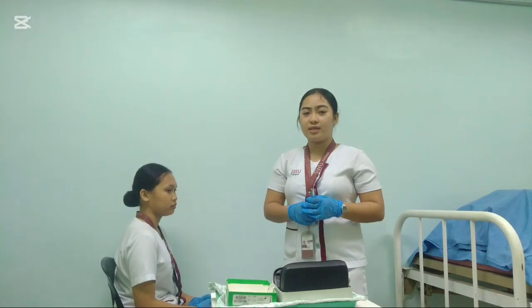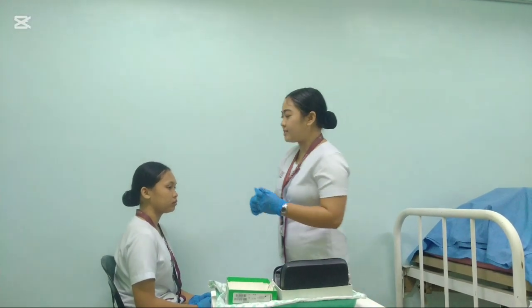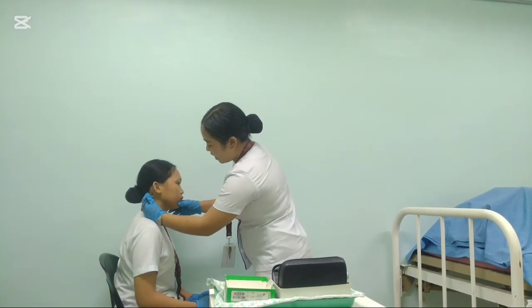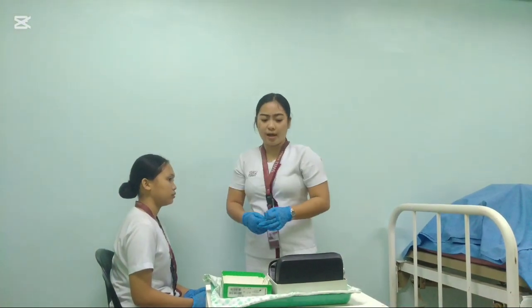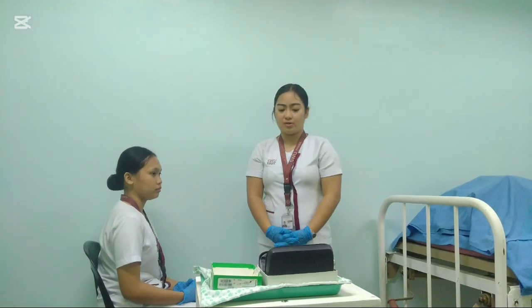Next is to perform the Rinne test by stroking again the tuning fork and putting it on the mastoid process. Do you feel any ringing sensation, Miss? No? How about this? Okay, so the air conduction of the patient is longer than the bone conduction.